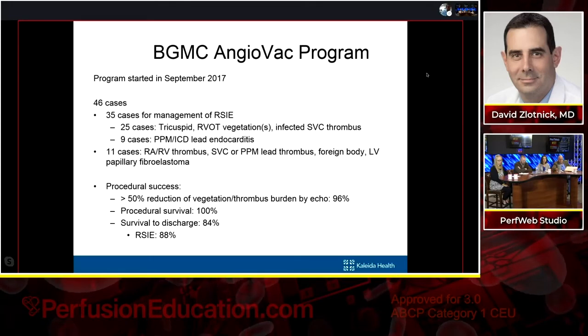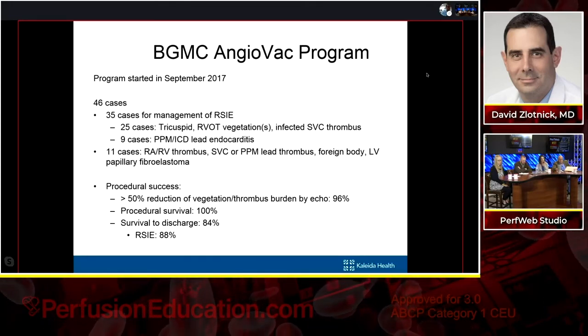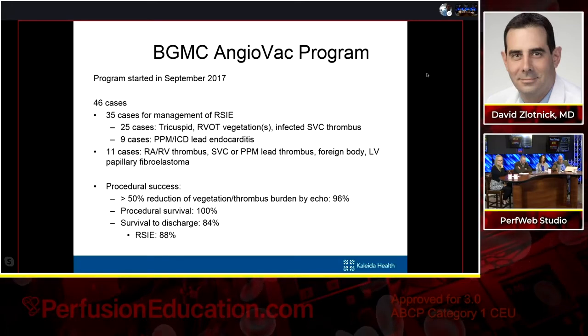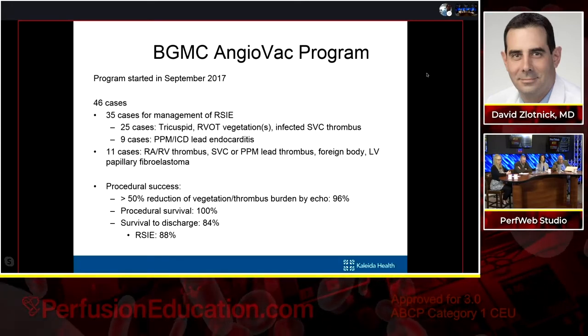Our procedural success rate, which we say is a greater than 50% reduction in either vegetation or thrombus burden by echo, is 96%. We have 100% procedural survival and an 84% survival to discharge, with right side infective endocarditis being 88%. So right in line with the historical data that we're seeing.